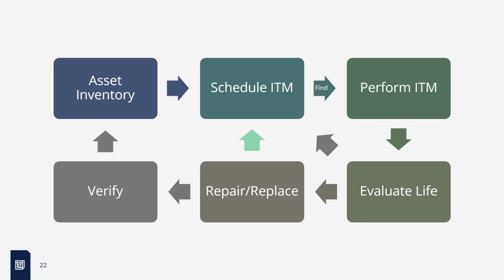Put your stickers on, your expiration date or last tested date or whatever you're putting on with different colored stickers or different dates on the stickers. And then verify in the asset inventory that it's still there. Track your last inspected date. That's key to help finding it as well. If you're doing it on a work order, where did you last perform that work order? Where was that at when you found it last? That might help you keep a trail of where that equipment might be in the future. If it's always in a certain area, then all of a sudden it's not.